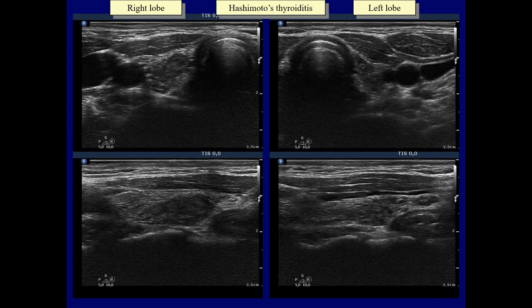One of the typical presentations of Hashimoto's thyroiditis is demonstrated in this patient. Both lobes contain moderately hypoechoic and hypoechoic discrete areas presenting fibrotic changes. The large hypoechoic area in the right lobe does not fit a nodule in a pathological sense; the shape of the lesion is not geometrical and the borders are irregular.